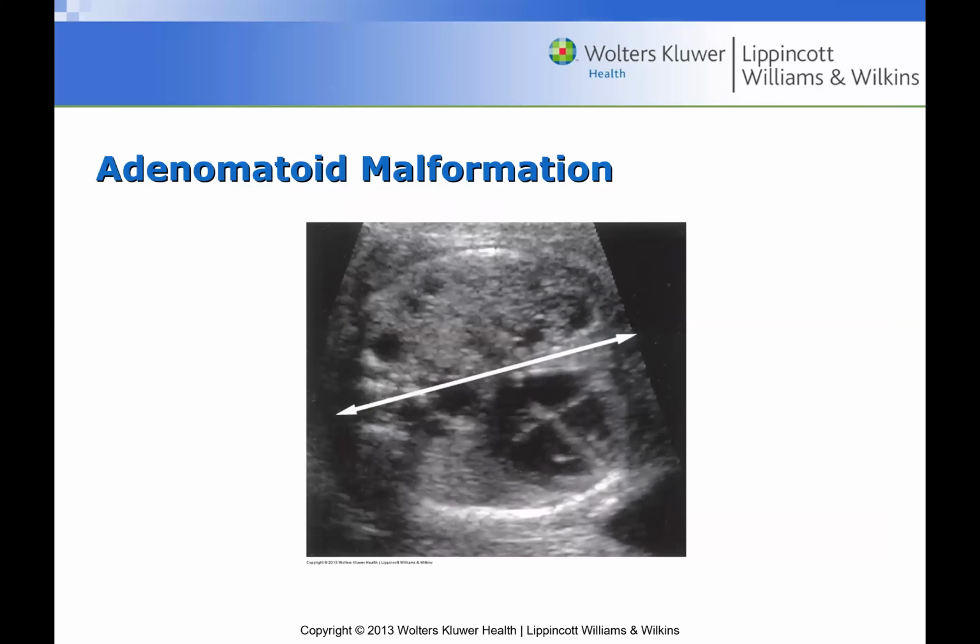Hey, a CCAM, we've talked about that before. This looks like a bigger cyst, so this is probably type 1 CCAM, and that can push the heart over to the right or left side, so dextrocardia or levocardia.